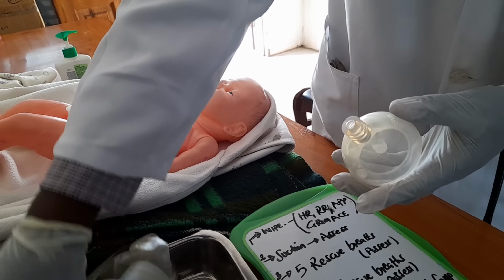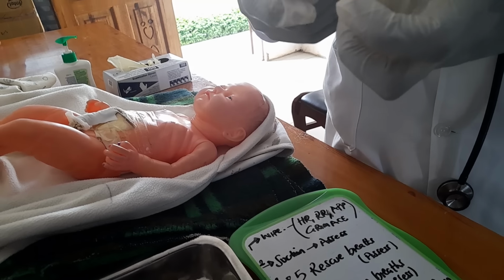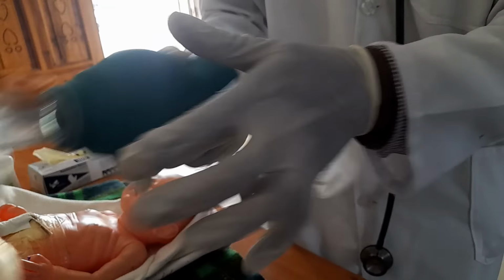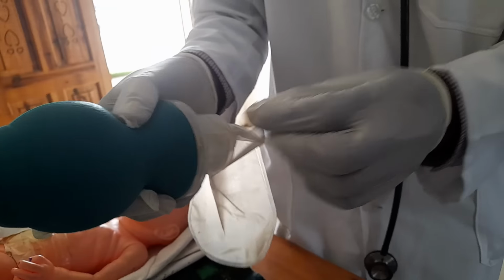So then you connect the mask to the ambibag. Ambibag, by the way, has to be connected to oxygen. There is a port here where you connect it to oxygen. So this would be connected to oxygen. So then you try it out. Okay, so this ambibag is working.